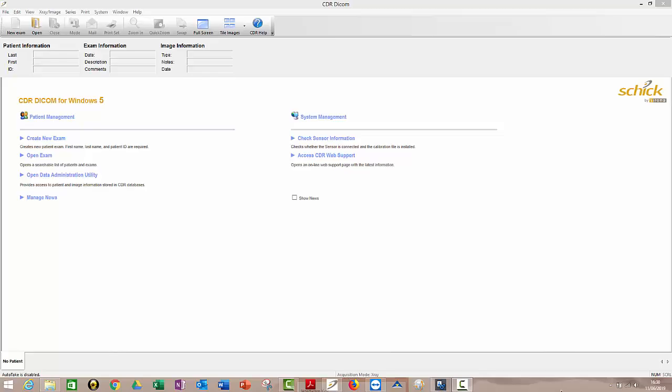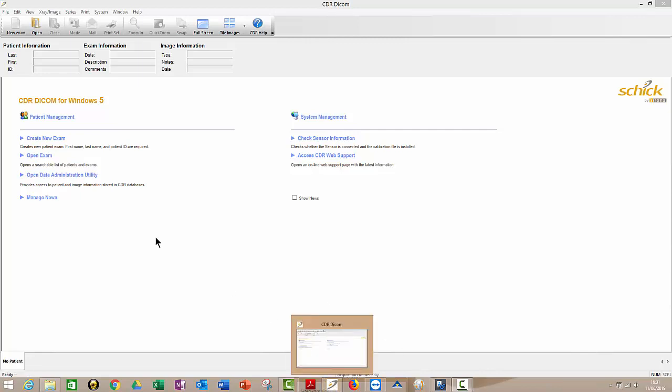This is Rain Leary from Clark Dental. It's a very short video to show vets how to use the Schick CDR software. So first thing you do is open up your Schick software. So here it is down here. So just open the software.